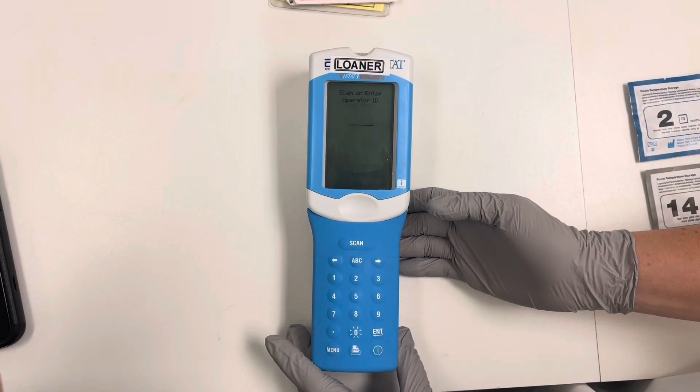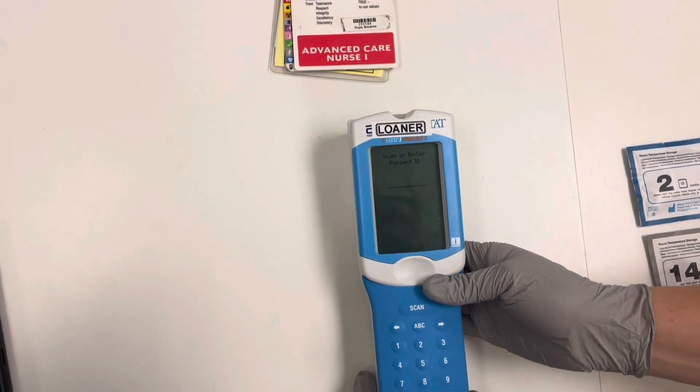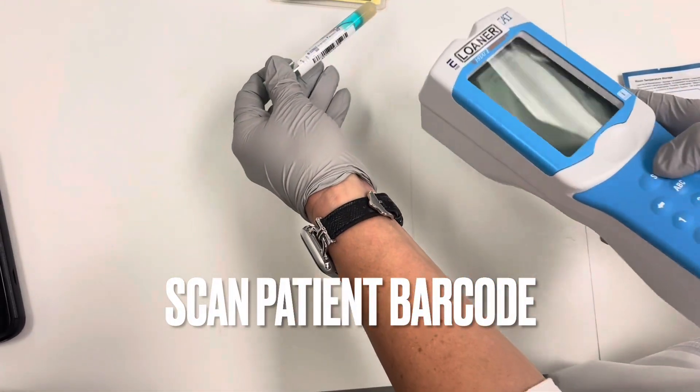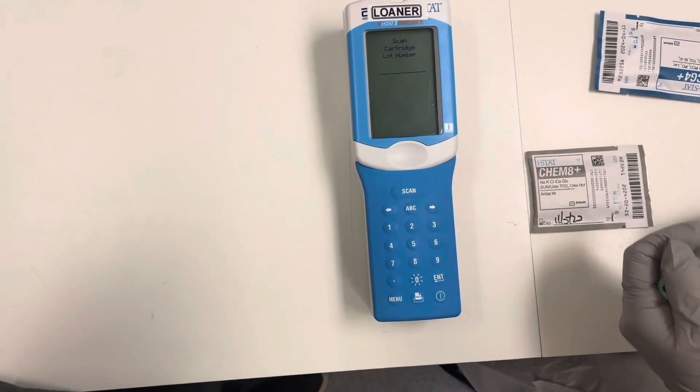We are going to hit 2 for iStat cartridge and then we are going to scan our barcode. We are then going to scan our patient. Here's our test patient. And then we are going to scan our cartridge.